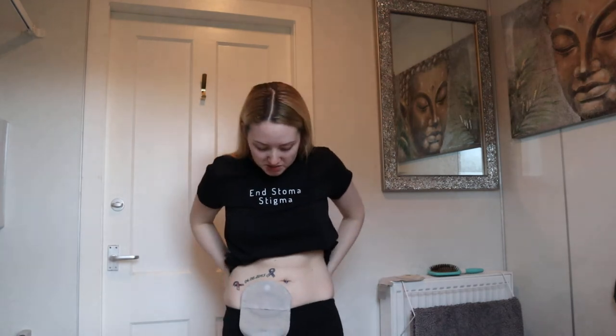Hi, it's Kylie Rebats here. I'm going to be showing you today what I use when changing my stoma bag. As you can see, I do need to step back a little bit just to be able to show you.